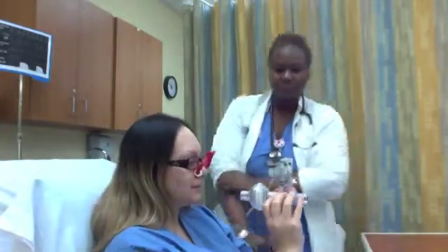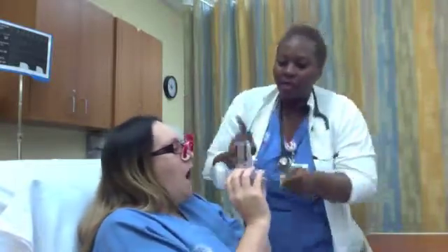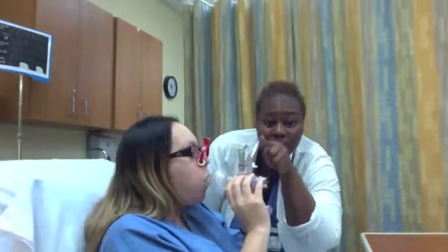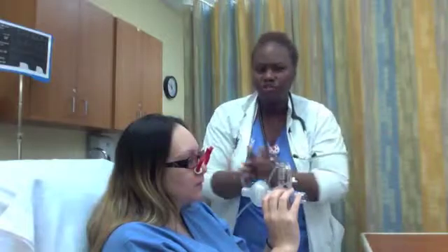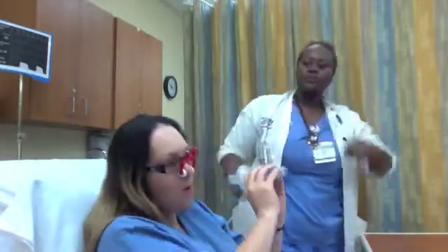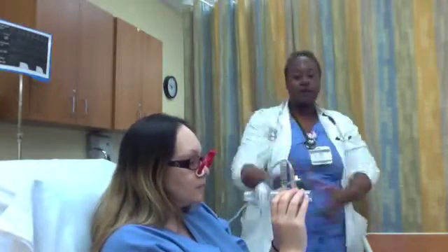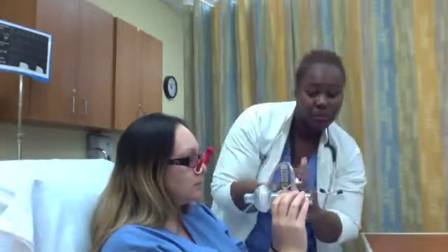We're going to make sure that we cover her nose with the nose clip — be comfortable. I want you to inhale using your diaphragm, take a big deep inhalation. And now I want you to push, push, push — exhale. Notice how I'm coaching my patient; it's very important. I'm checking my manometer. She's going to repeat this process; I want to make sure she does about 10 to 20 breaths. After the 10 to 20 breaths, I'm going to make sure she takes a huff cough — three huff coughs. My pressure manometer was set at 10 centimeters of water pressure. Notice how when she was exhaling there was a red ring in the middle and it increased, letting us know how many centimeters of water pressure she's pushing against when exhaling.